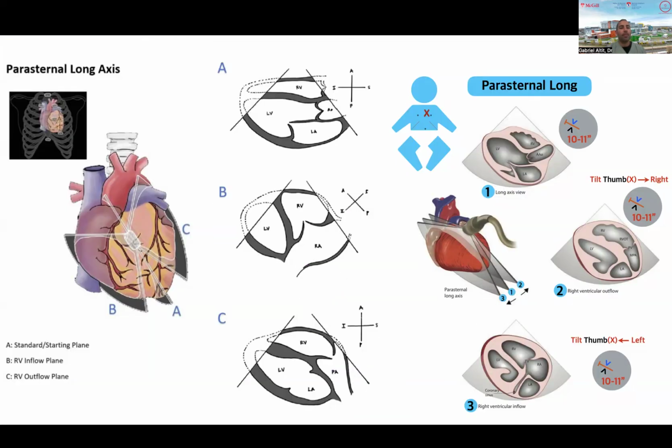Can you explain for a second what these diagrams are next to the views, the two arrows and the 10, 11? These things? No, well, yeah, I guess the ones I was looking at.